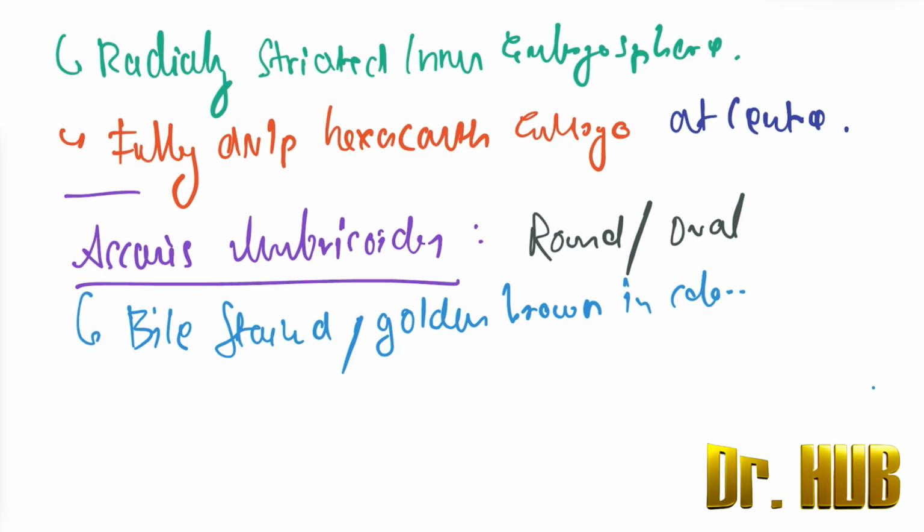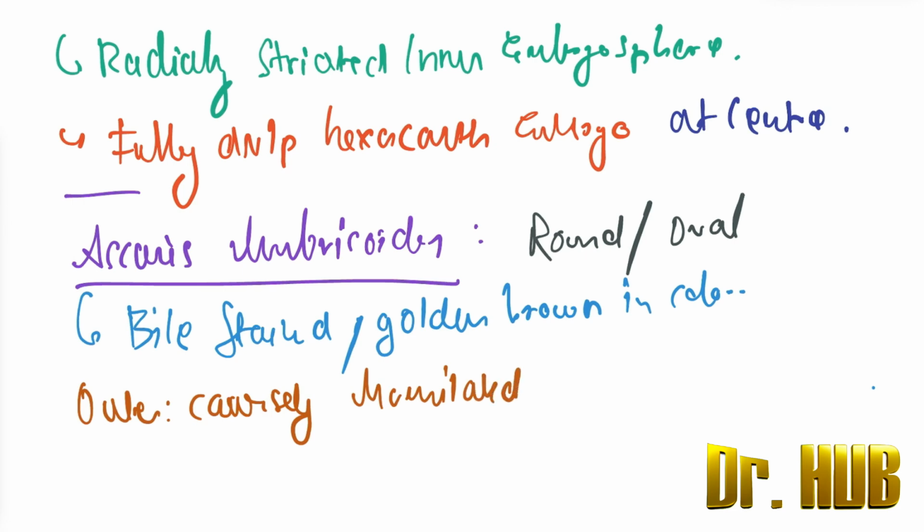They have an outer coarsely mammillated albuminous coat.